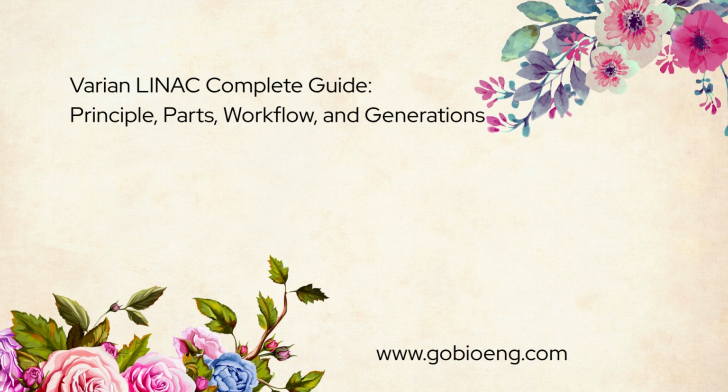Now let's walk through the main parts of a Varian-style LINAC. The electron gun produces the initial electrons. The RF system provides the microwave energy used for acceleration. The accelerator waveguide is where those electrons gain their energy step by step as they move forward. The bending magnet shifts the direction of the electron beam, guiding it onto the correct path. And finally, the treatment head contains the components that shape and monitor the beam.